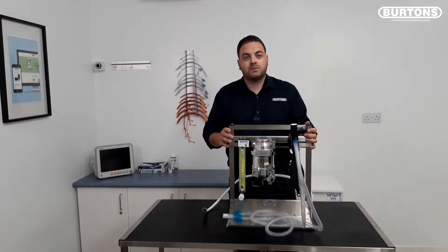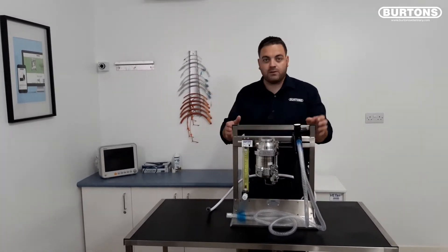This machine is ideal for saving space in the practice, saving floor space and getting it out of the way on the wall.